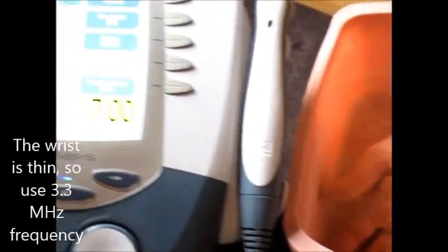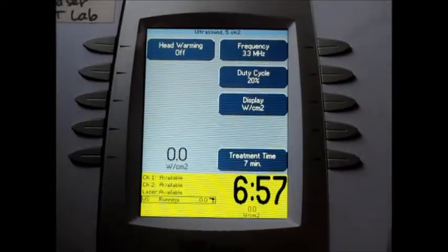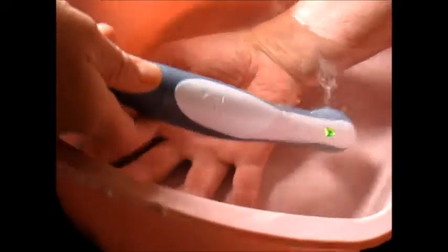Before the ultrasound works, you actually have to hit the Start button, and then you should have either your coupling gel or water. We're going to be doing this underwater to show you that you can do these things under the water. I'm now going to be bringing up the intensity, and you can see the green light is turned on.